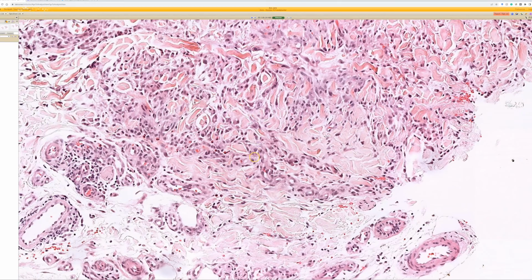The other reason I want to bring it up is that if you don't see the central necrobiosis and you just have this, it looks an awful lot like the peripheral edge of a dermatofibroma. Dermatofibromas classically have collagen entrapment at their periphery, and that's also what GA does. When you just have this pattern of collagen trapping and don't see good mucin, we call this the interstitial pattern of GA, or interstitial granuloma annulare.